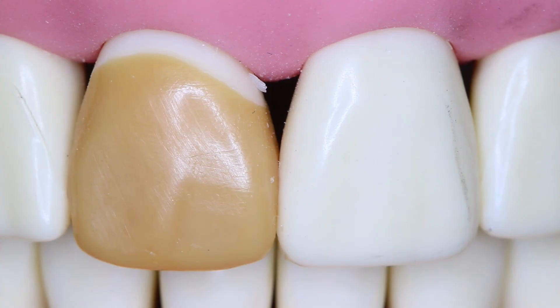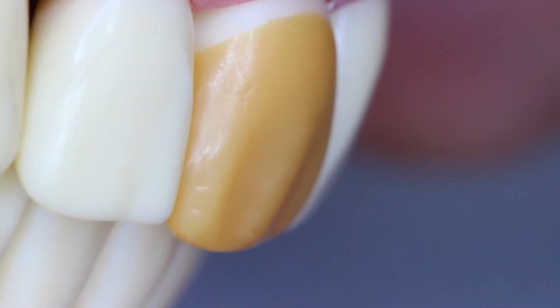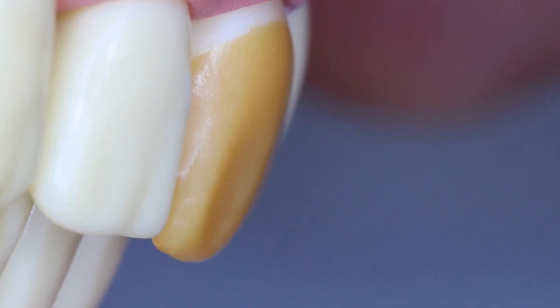Looking at the overall shape of the tooth in general, number 8 appears to be more ovoid while number 9 appears to be more rectangular. What will help correct this is if we had a more cervical margin, we would have more room to extend the length of this tooth. If we went to the incisal edge and flattened it off, this tooth would start to look more rectangular and less ovoid. As we rotate the tooth around, we can check for facial contours and facial profile. From this view you can see the cervical area of number 9 and the shape going back into the mouth, but from the distal view I cannot see the incisal edge.